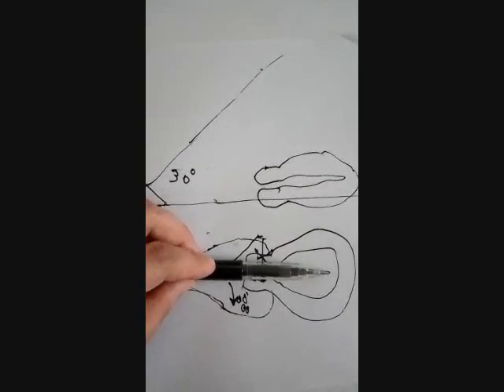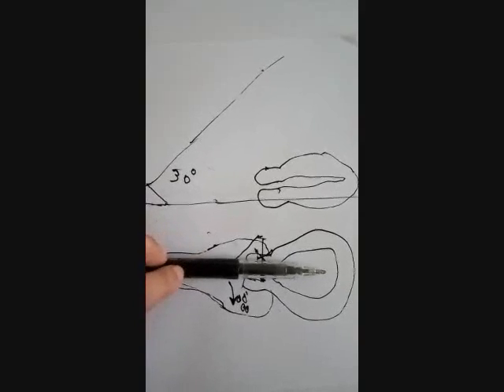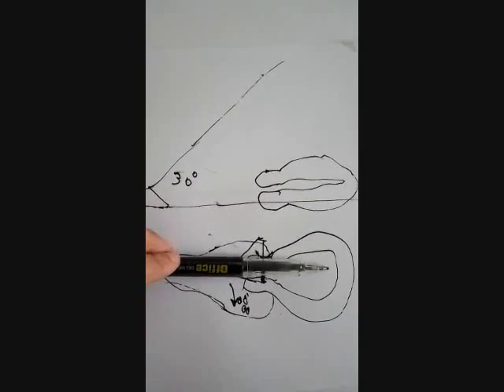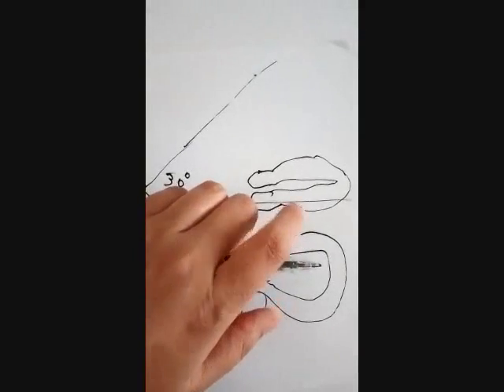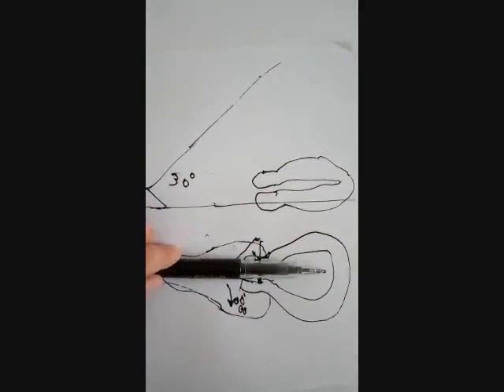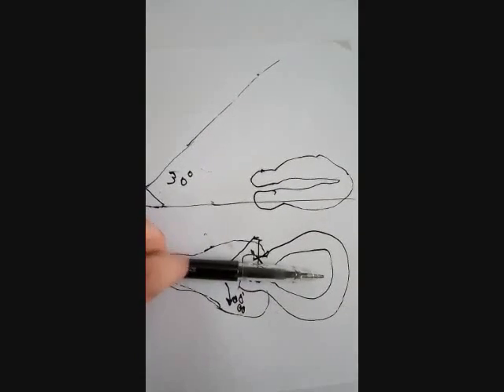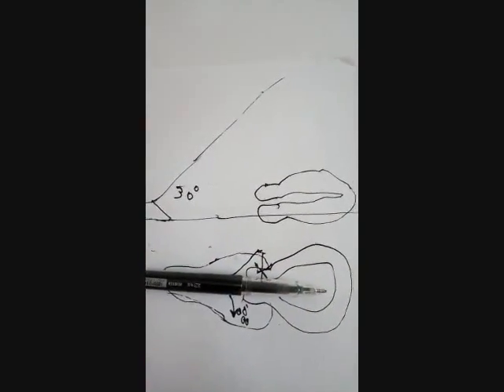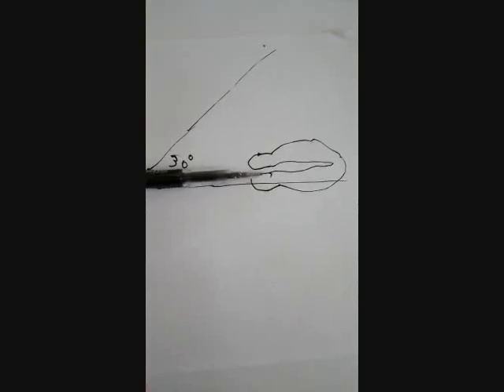It's very important. Once we reach the fundus, we rotate the cable. We put the cable here at 3, for example, to see what's happening at 9, the right ostium. And then we rotate the cable. We put it at 9 to see what's going on at 3, or the left ostium.